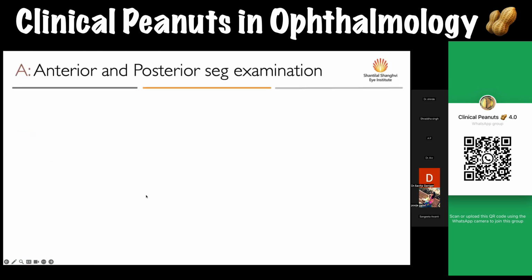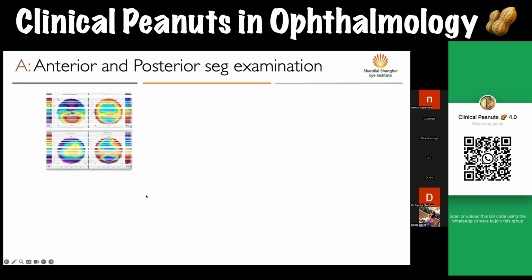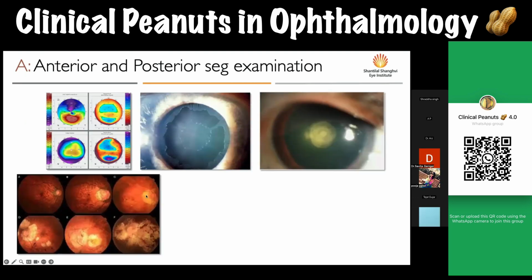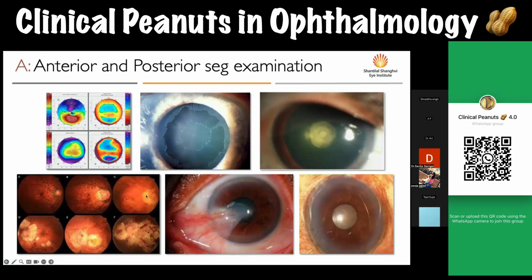Now, most cases of regular astigmatism are suitable for toric lenses. There are some relative contraindications, not absolute, I would say, to placement of these lenses. One is, of course, any absolutely irregular corneal astigmatism, because getting a keratometry value to place in your calculator might be difficult in such cases. Any cases where you anticipate that the zonules are weak or the pupil is small might create surgical problems for you in placing the lens and affect the stability of the IOL post-surgery.